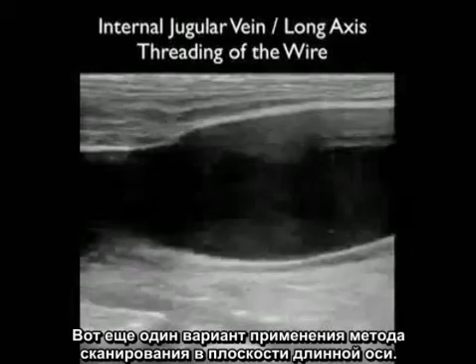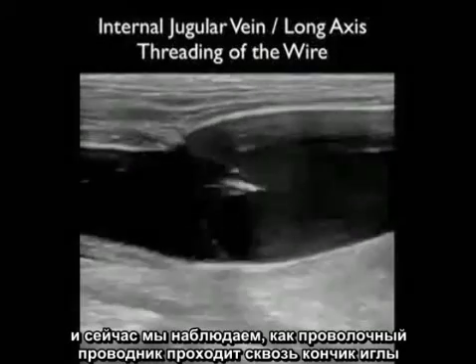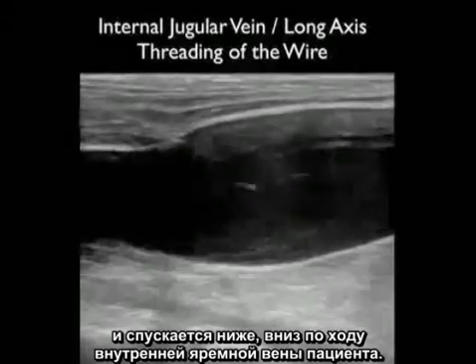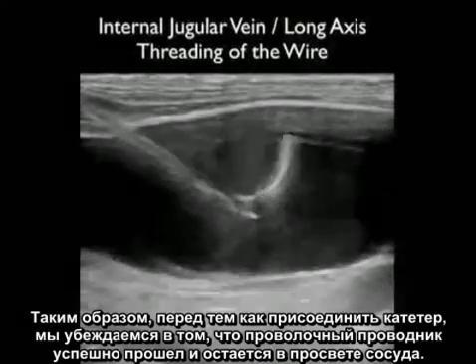Here's another great use of the long axis technique. Again we're confirming that the needle tip is located within the vessel lumen, and now we can watch as the guide wire passes through the tip of the needle and moves down inferiorly along the patient's internal jugular vein. This is a great way of confirming that the guide wire is safely parked within the lumen of the vessel before threading the catheter.